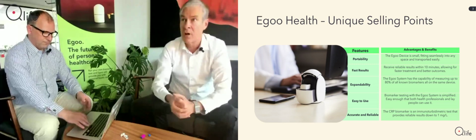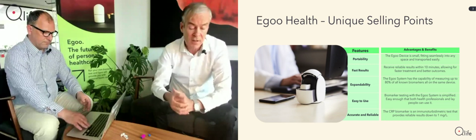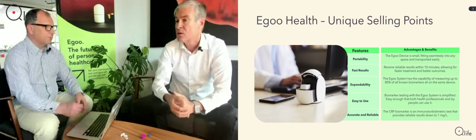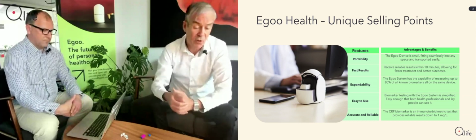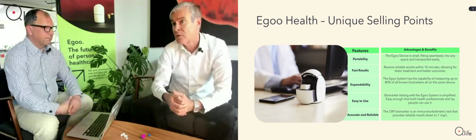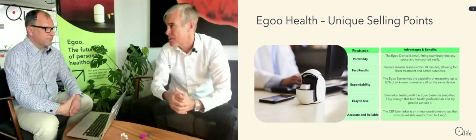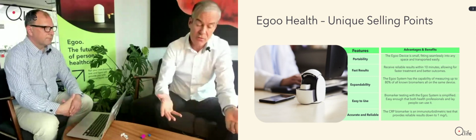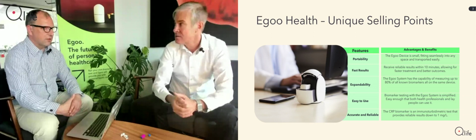This is something that your doctor will decide. And interestingly, once the CRP number starts to fall, you can actually go off antibiotics. So it also relates to the term that we call antibiotic stewardship, where people or societies in general are very interested in limiting the use of antibiotics. So with CRP, you can basically start to monitor when you should get off antibiotics. I think that's interesting. Very interesting. Yes, good application.